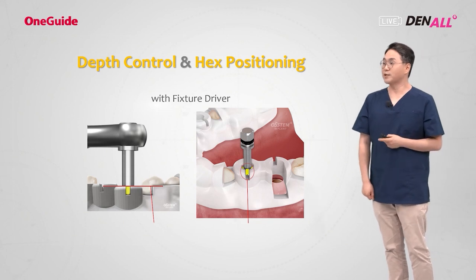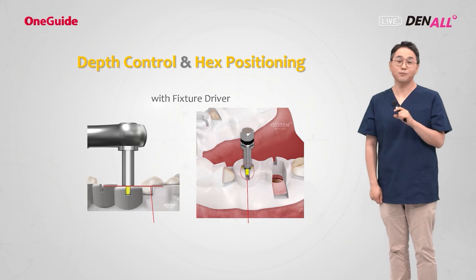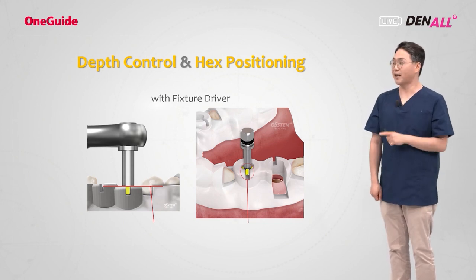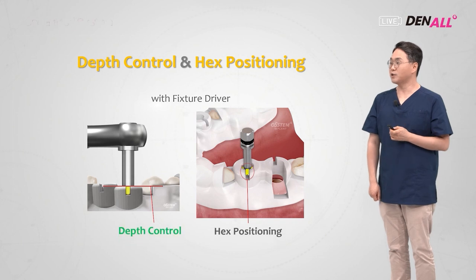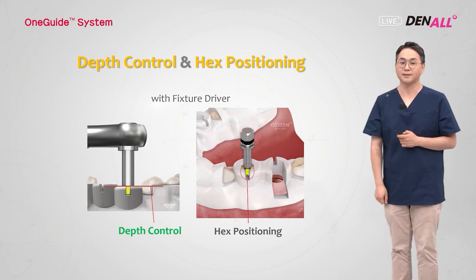Using the fixture driver, the remaining 20% of the placement can be done by checking insertion torque like this. Hex positioning and depth control can be done. The top of that should align with the top of the guide hole.